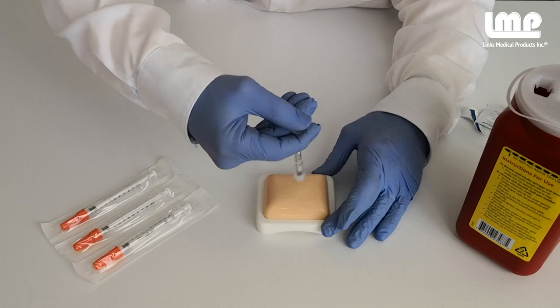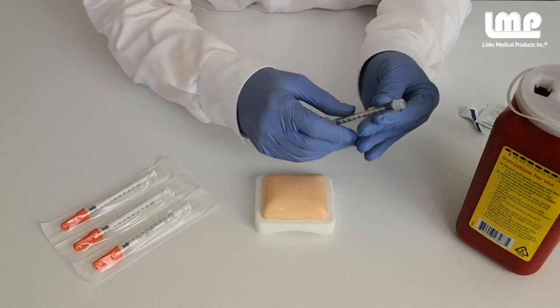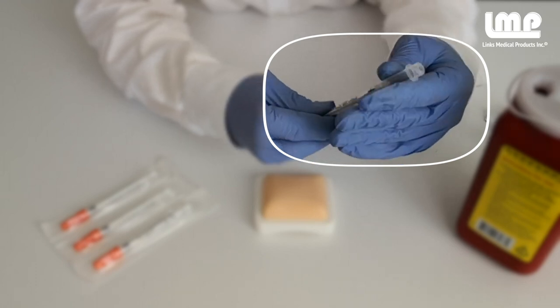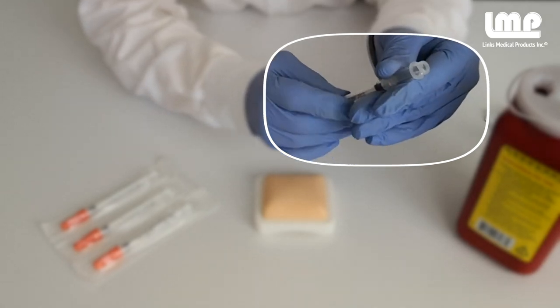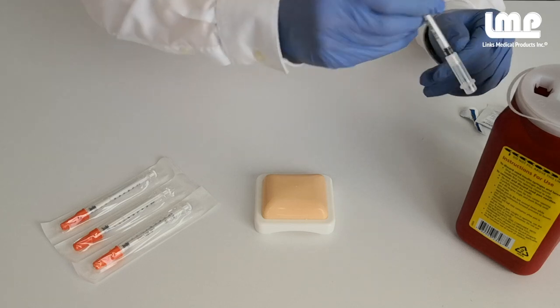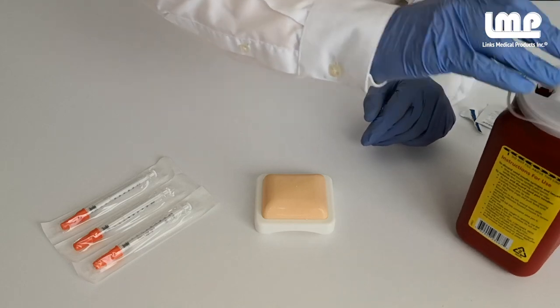When you've finished the injection, you need to permanently lock the safety shield. This is done by sliding the safety shield forward over the needle until you hear a click. Then twist the shield in either direction until you hear another click. Now the safety shield is permanently locked and safe. Then discard the syringe into a sharps container.